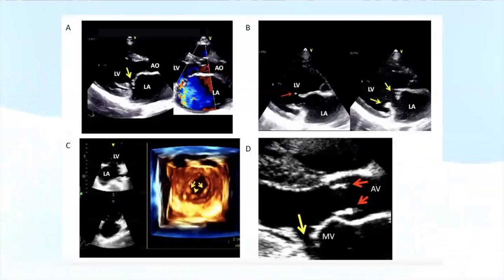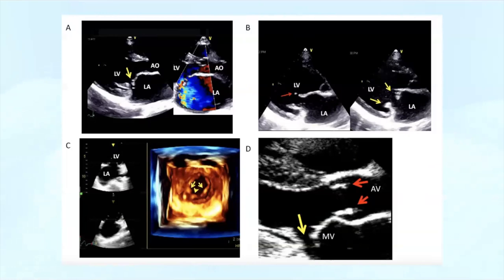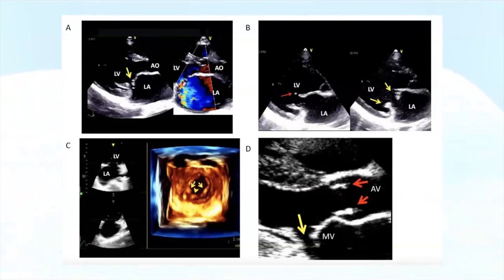This is an echo from a 10-year-old boy with acute rheumatic fever. You can see cordal rupture of the anterior leaflet with severe mitral regurgitation that's eccentric and posteriorly directed. The torn cord is visible in panel B with the red arrow, and nodular thickening of the mitral valve leaflet tips is already starting to occur in the parasternal long axis. Panel C shows a 3D echo demonstrating the nodular thickening of the leaflet tips, and panel D shows the aortic valve is also involved with some thickening and calcification.